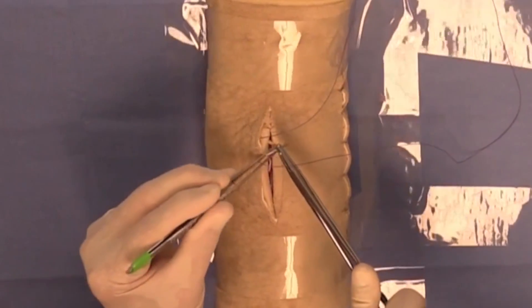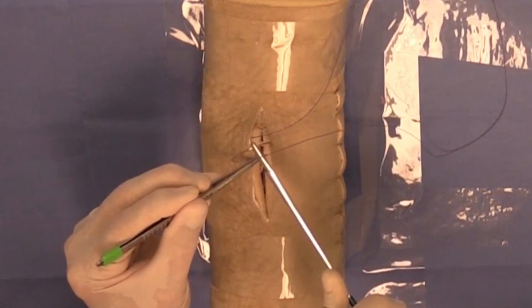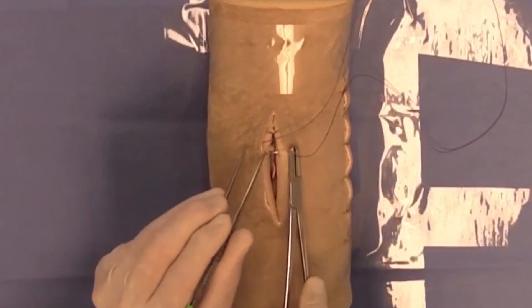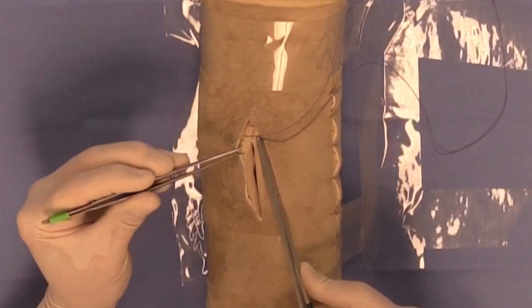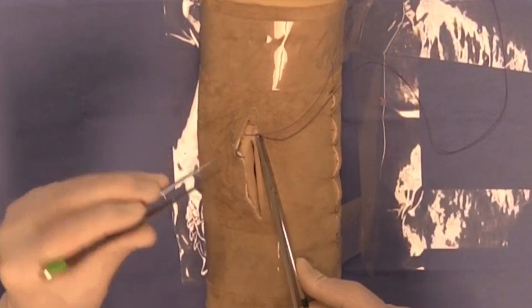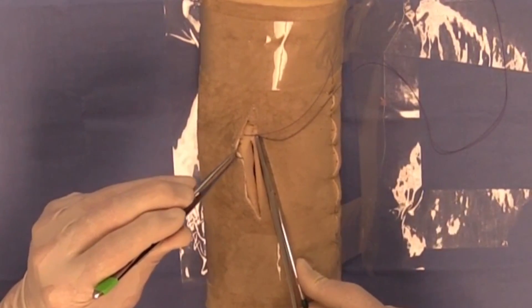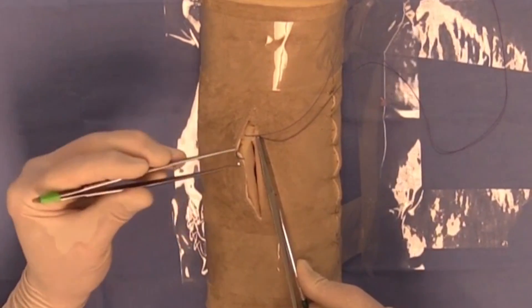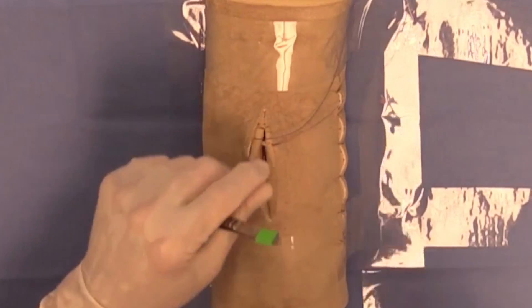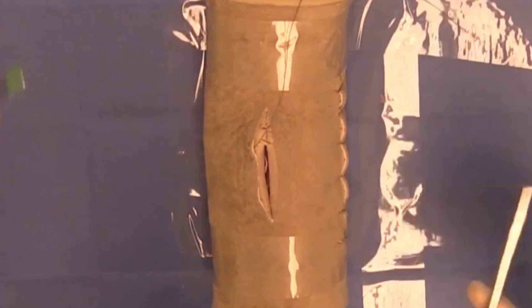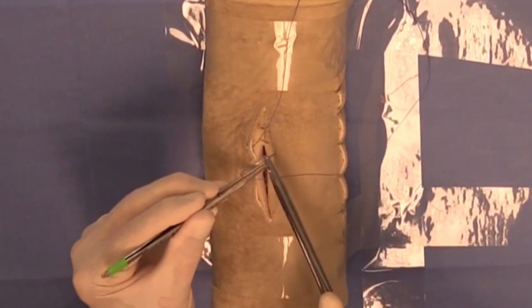In life you might have an assistant surgeon that would be helping you run the suture. Here notice I'm grasping the needle not by the actual teeth of the rat tooth forceps but encircling, stabilizing, pulling through, snipping, and I'm ready now to begin my bite.